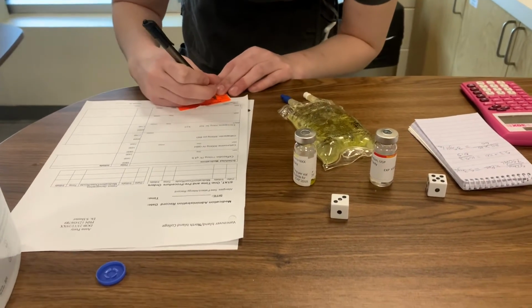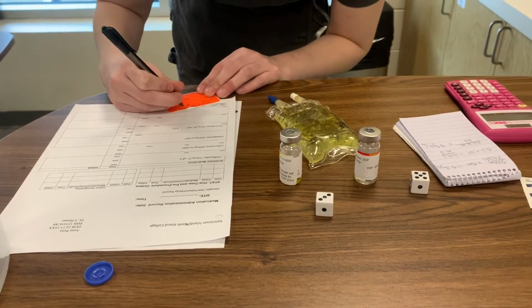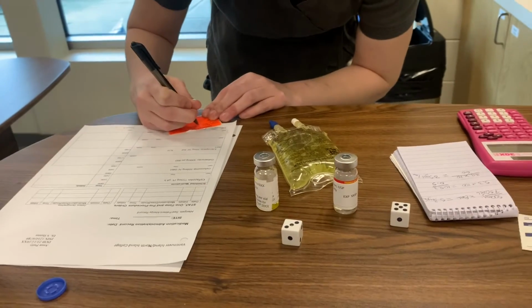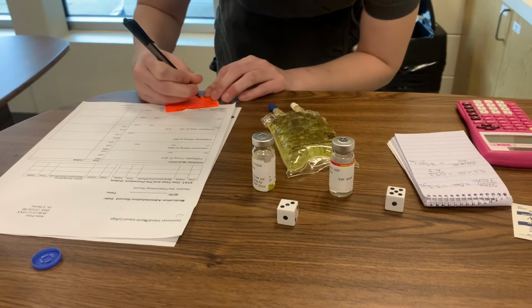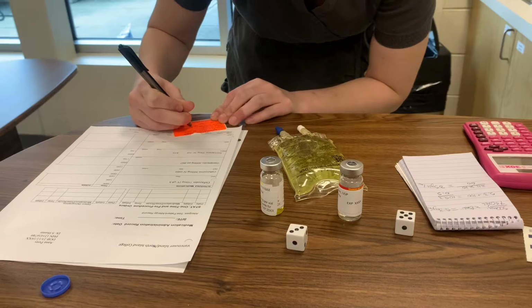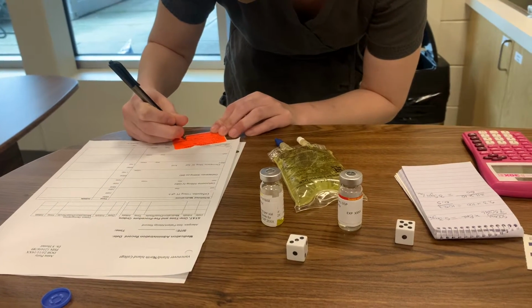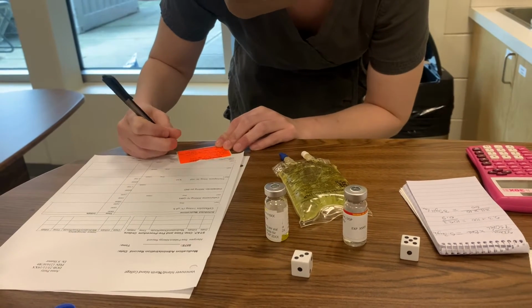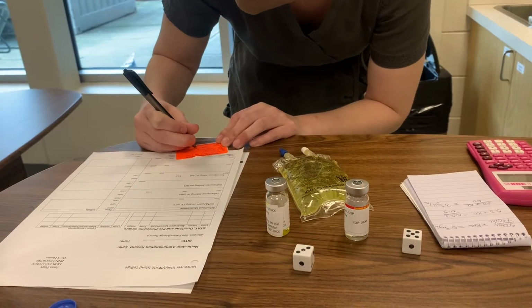So I have Anna Perry, room number 206. Drug she's getting is cefuroxime. She's getting 500 milligrams of that, added by Shea White, PNS, NIC. And it is currently at 0800. Flow rate is 35 GTT per minute. The date is January 20th.